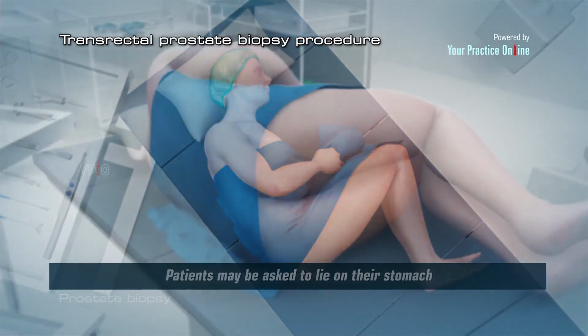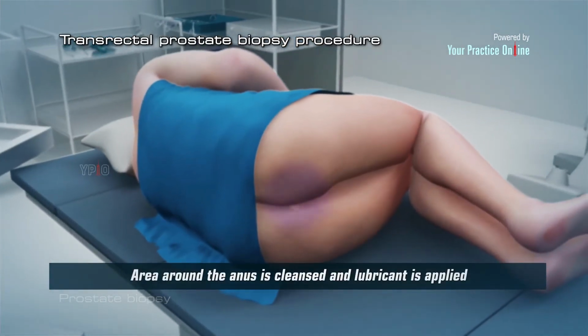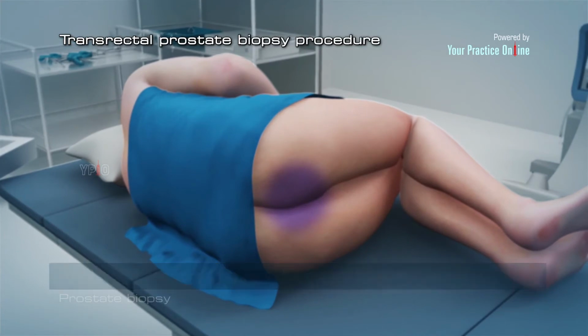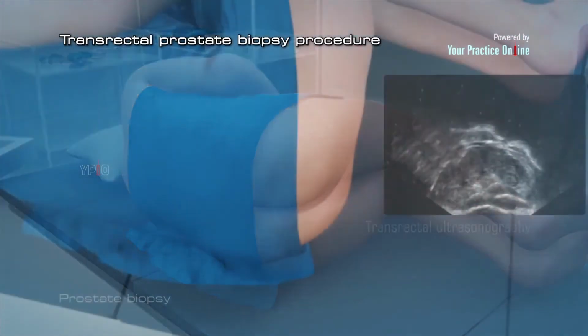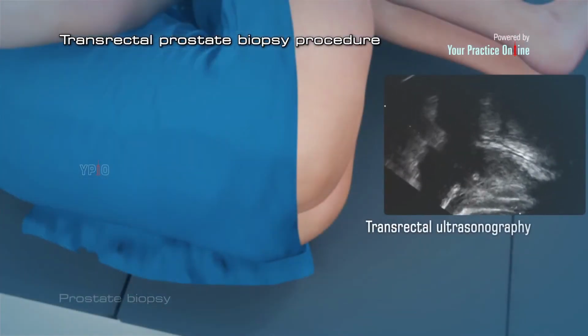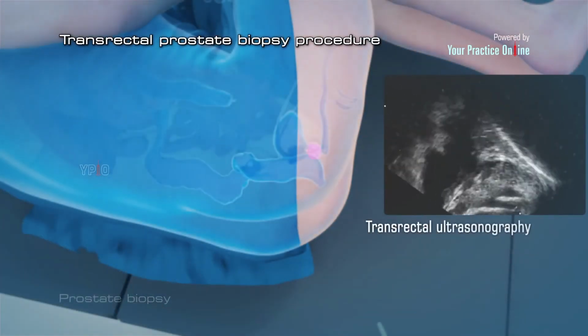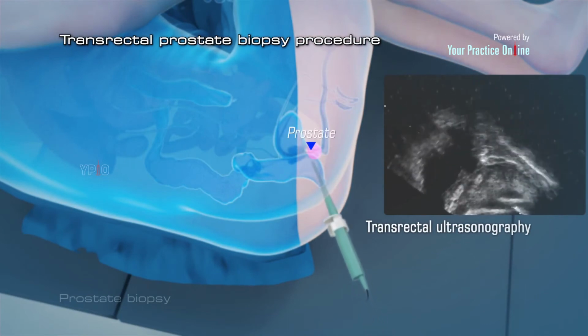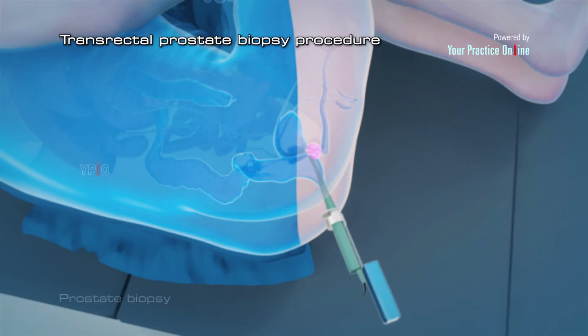The area around the anus is cleansed and lubricant is applied to enable smooth insertion of the ultrasound probe into the rectum. Images are generated with the help of transrectal ultrasonography to assist the urologist in guiding the biopsy needle to the prostate. Local anesthesia is given to reduce the discomfort related with prostate biopsy.